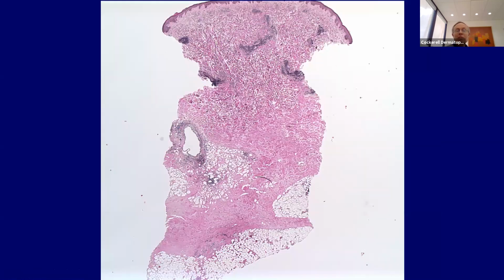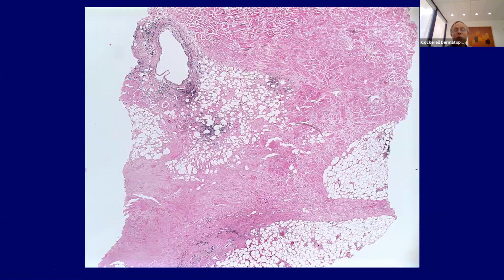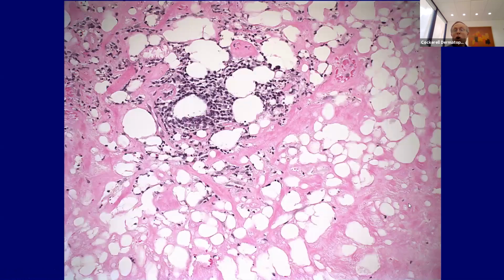And here you see a biopsy of LE profundus. You'll often again see changes of overlying lupus. So you've got the lymphocytic infiltrate here, and then the diffuse lobular panniculitis that's thickened and basically replacing the fat here. So this isn't just septal thickening, this is replacement of the entire lobules with this thick hyalinized sclerotic collagen and sclerotic fat, and then the lymphocytic and lymphoplasmacytic infiltrate. So this is that mummified, fibrin-like sclerotic fat here. This is pretty much pathognomonic for LE profundus when you see this pattern.